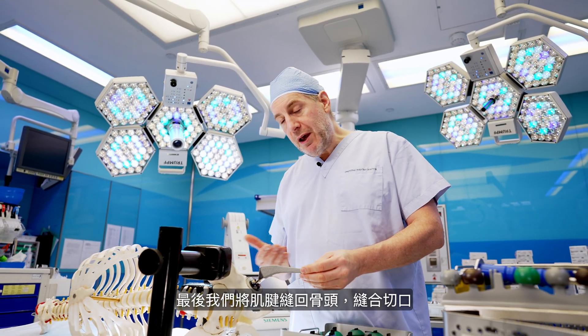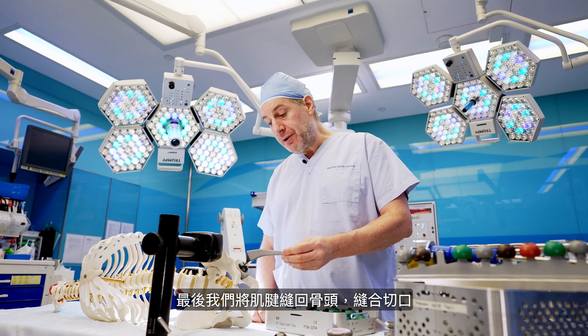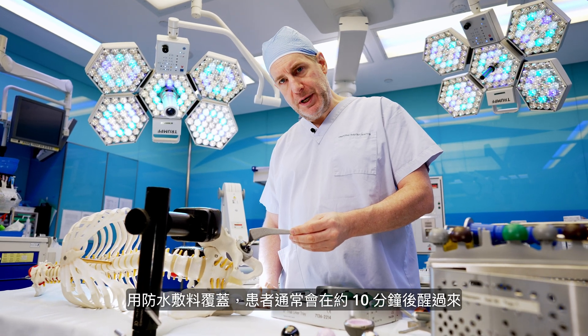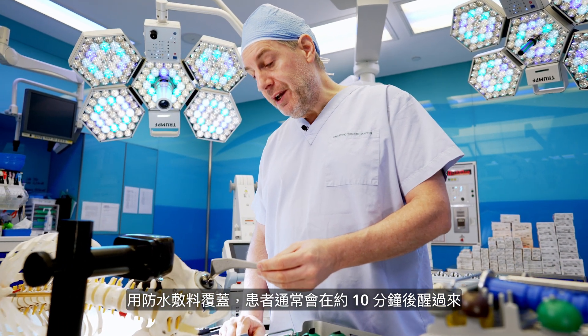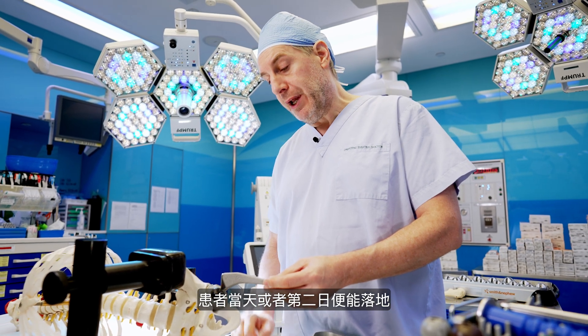Finally, we stitch the tendons back to the bone, stitch the incision closed, apply a waterproof dressing, and the patient will be awake about 10 minutes later — and usually walking the same day or the very next morning.